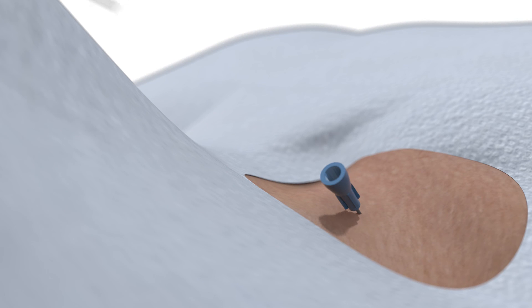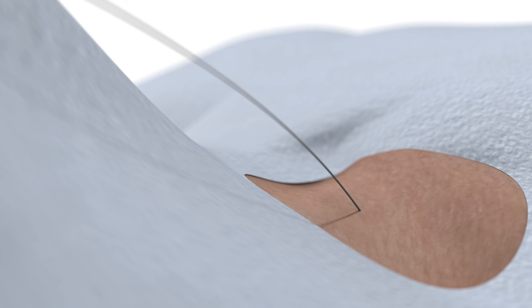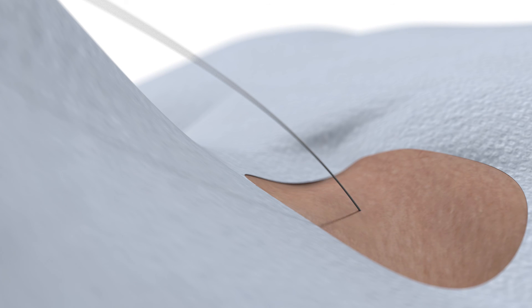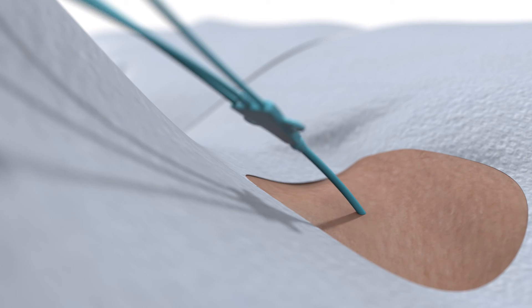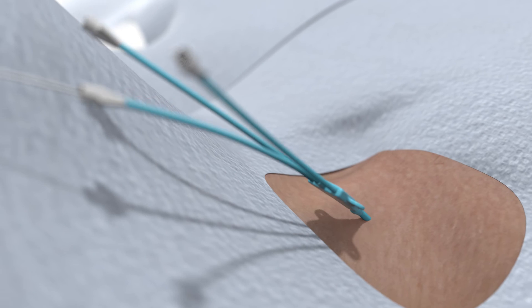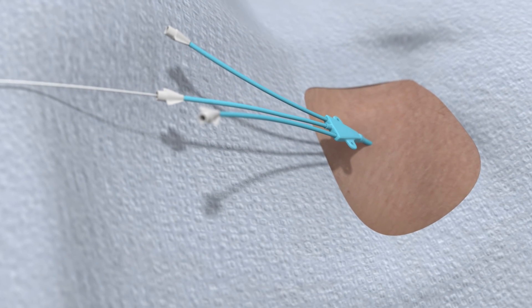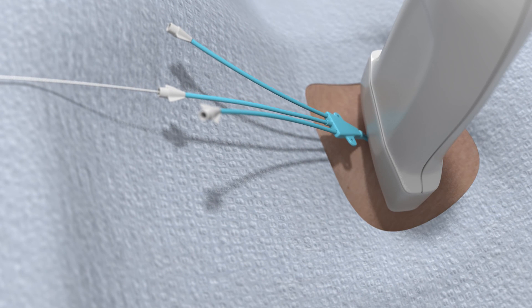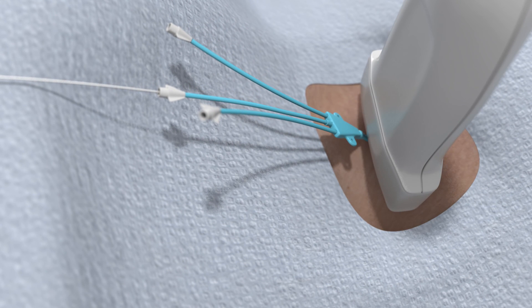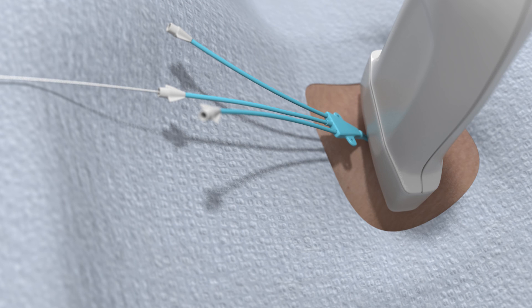Once the needle has penetrated the vein, the syringe is removed and a guide wire is inserted through the needle. The central venous catheter is placed over the guide wire and into the vein. Ultrasound is then used to confirm the location of the catheter in the vein.